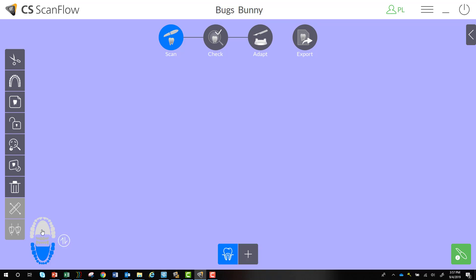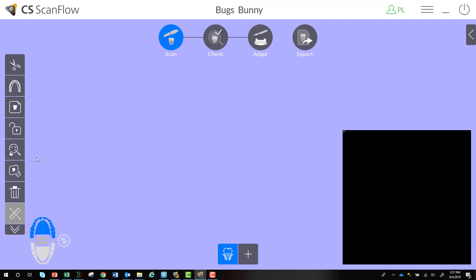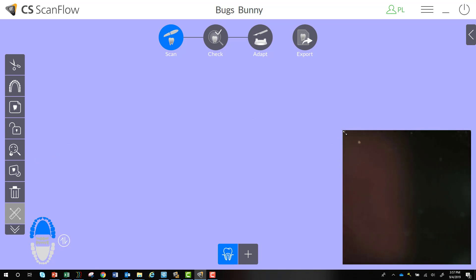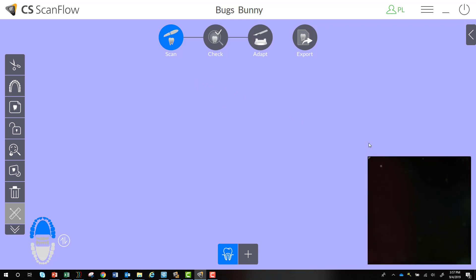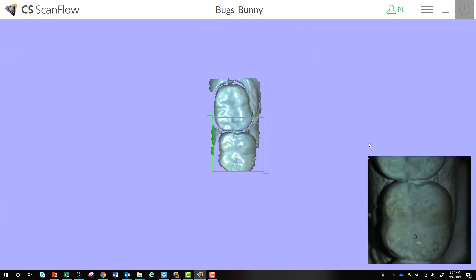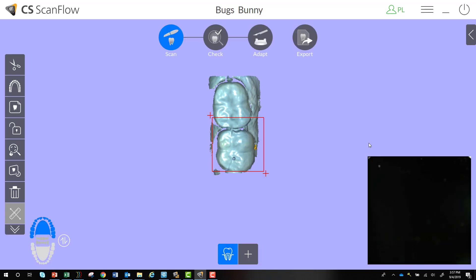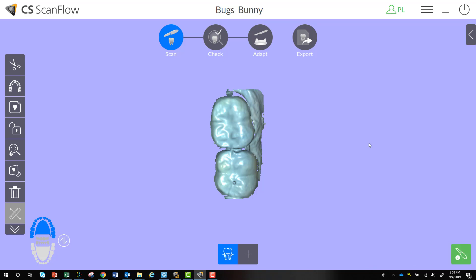Switching from upper to lower is now done with this icon. Once you have upper and lower, you'll be able to select your buccal bite options as well. Another new feature is that when you lift up your handpiece, you can resize the acquisition screen. You'll also notice that when you start scanning, all the icons and toolbars disappear so you can really focus on what's being scanned.